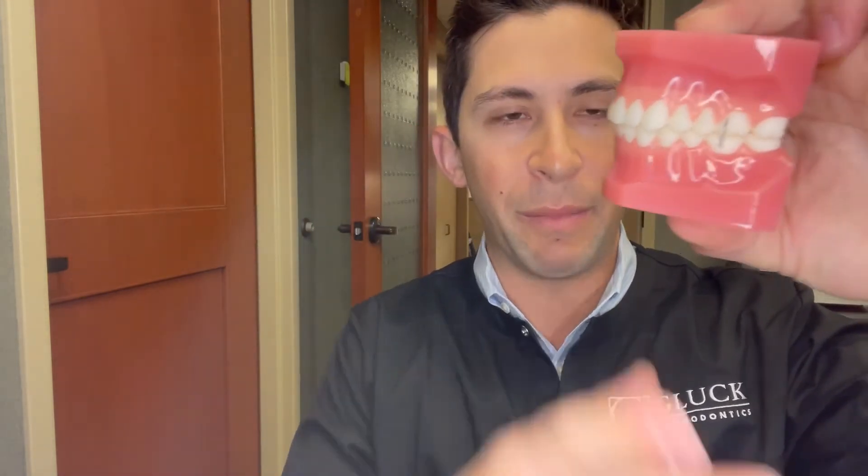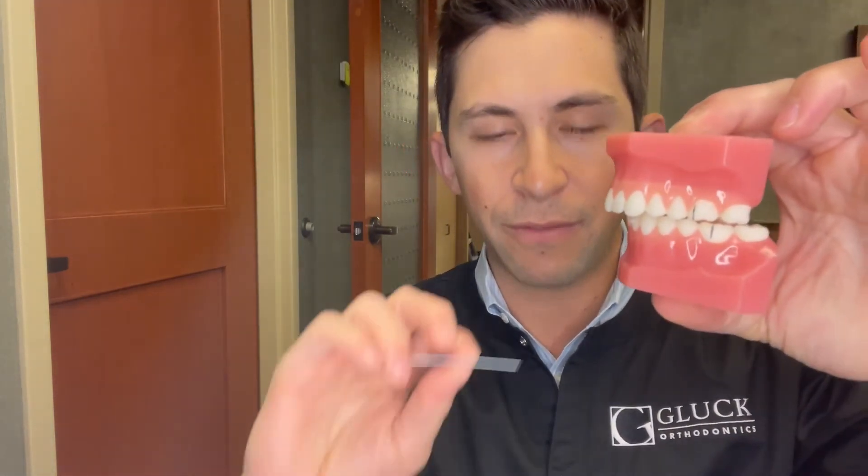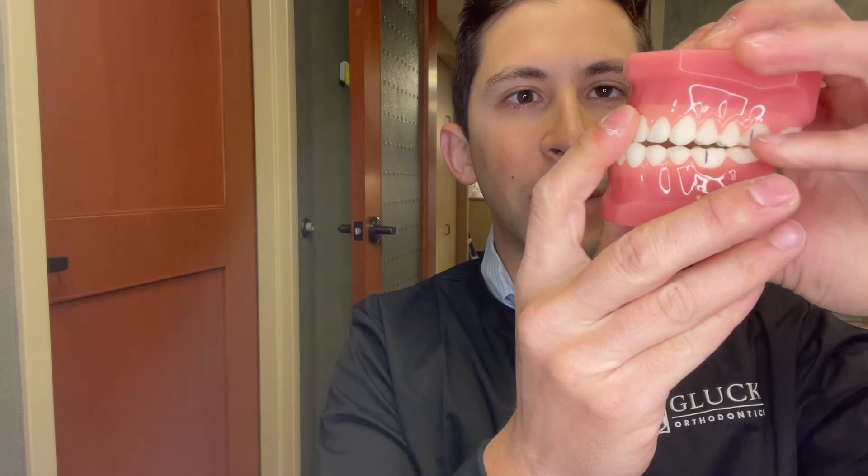For example, placing the ruler here, that's around three millimeters of overjet — a three millimeter distance from the upper incisal edge to the labial surface of the bottom front tooth. With more overjet, that's more like nine or ten millimeters. You could also have zero overjet — an edge-to-edge bite — or overjet expressed as a negative number if the lower anterior teeth are actually ahead of the upper anterior teeth, which we'd call something like a negative one overjet, or an underbite.